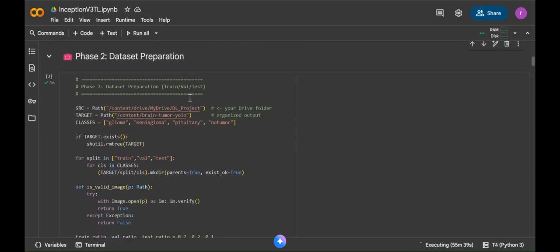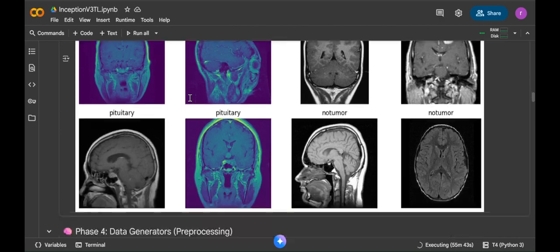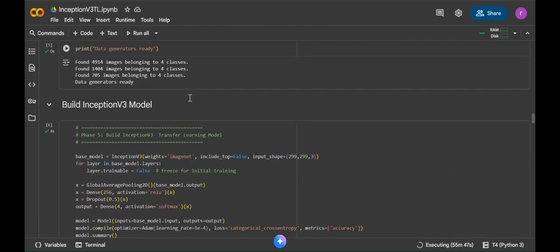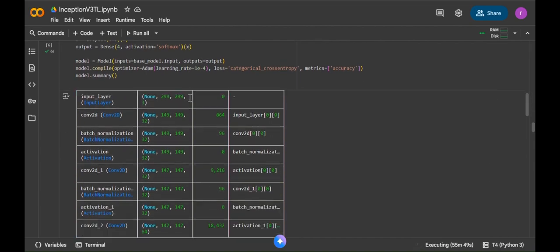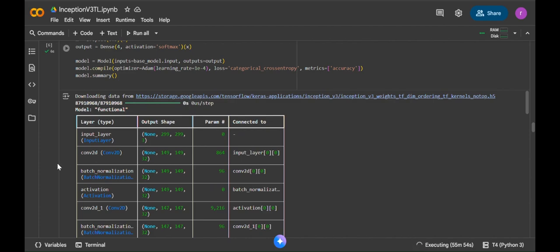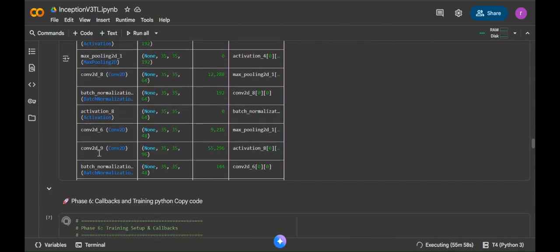Hello everyone. Today we are excited to present our deep learning project for the module SE4050, Deep Learning. Our project is titled Brain Tumor Detection Using Deep Learning Techniques. This project focuses on an important area of healthcare, the early detection of brain tumors using artificial intelligence.